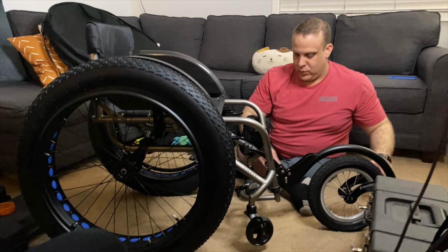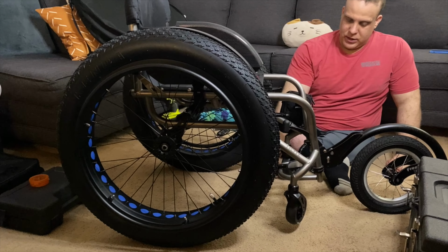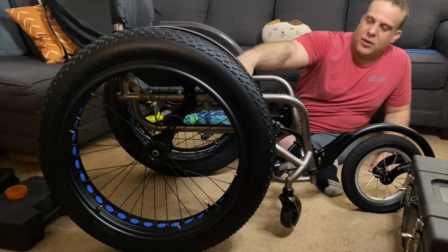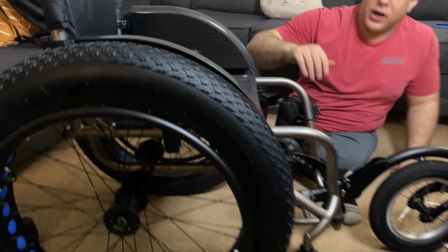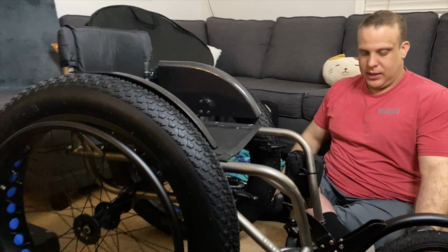And actually, look how much clearance we get. So that's going to be great when we're on the beach. It'll keep my front casters up and out of the sand. And see how much it levels out my sitting surface. So I'm not going to be forward, I'm going to be comfortably back in the chair, and that's going to be great.